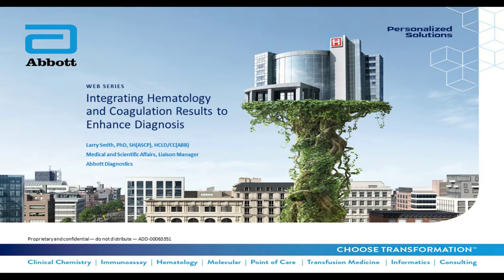What additional testing would you do in coagulation to identify acquired von Willebrand disease? To identify acquired von Willebrand disease, we would need to do some more specialized coagulation testing such as factor VIII, von Willebrand factor activity, and von Willebrand factor antigen.